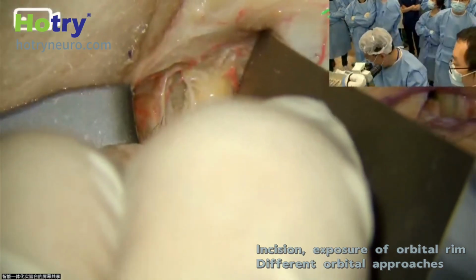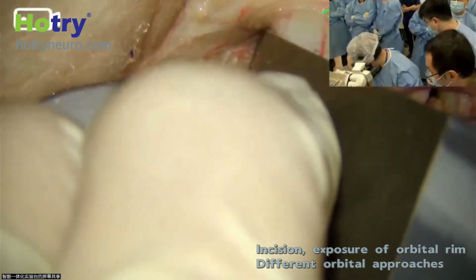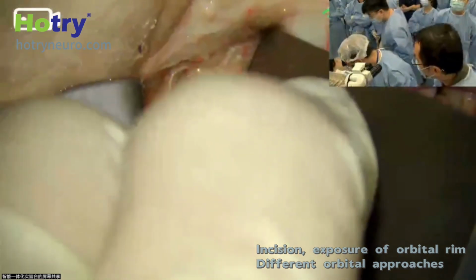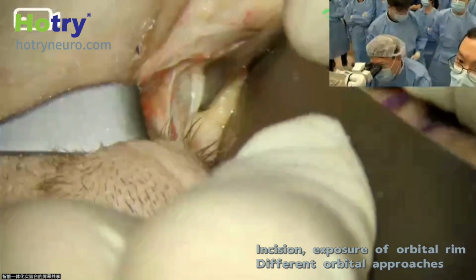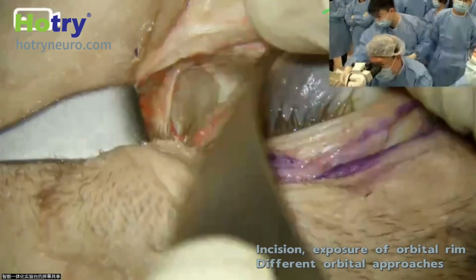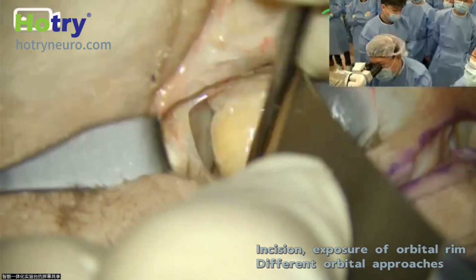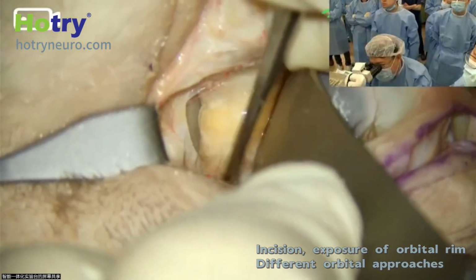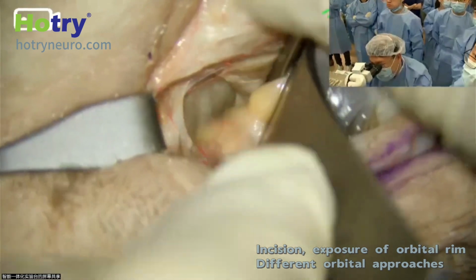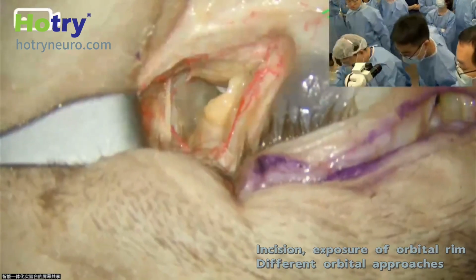Then we can use a Freer periosteal elevator to do the subperiosteal dissection. So now, can you see the medial wall? In fact, through this medial wall, you can see the anterior and posterior ethmoidal vessels nicely. If you want to enhance your visualization, you can put your endoscope inside.